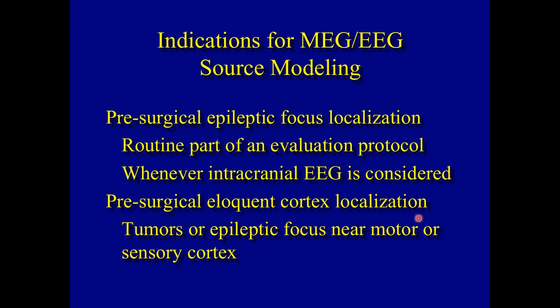So what do we use this thing for? Well, the indications of MEG are pretty simple.